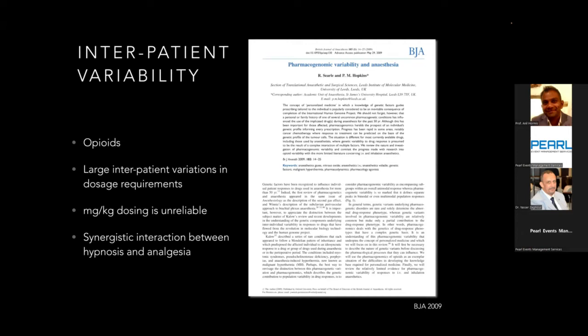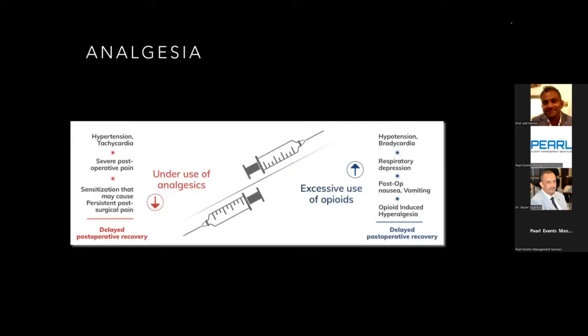And if I was to give each and every one of you on this call 10 milligrams of morphine as an example, there would be up to a 30-fold variation in how we'd all metabolize it. The pharmacokinetics involve the size of the stimulus, how the patients perceive stimulus, and also how our bodies react to the stimulus. So we really do need a monitor that can give us some ideas into how we are metabolizing and using the opiates.